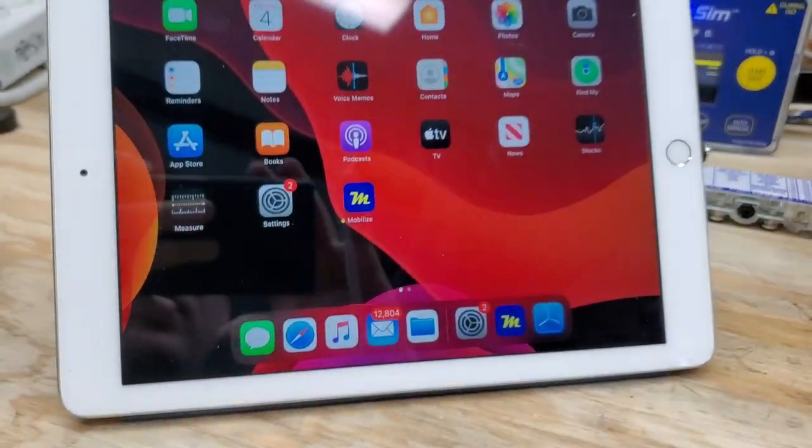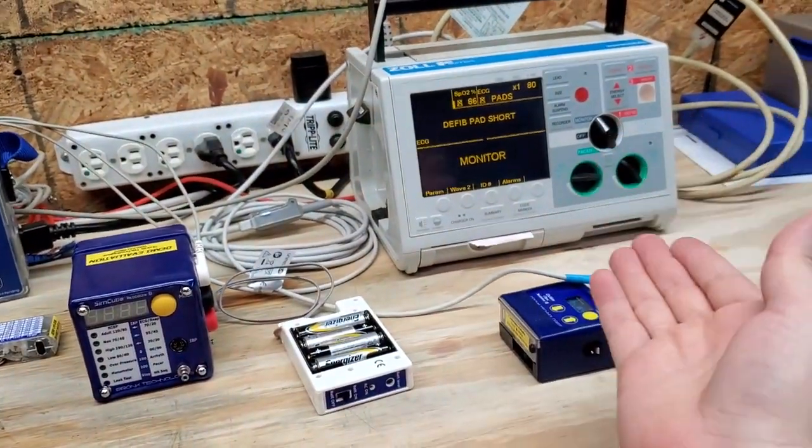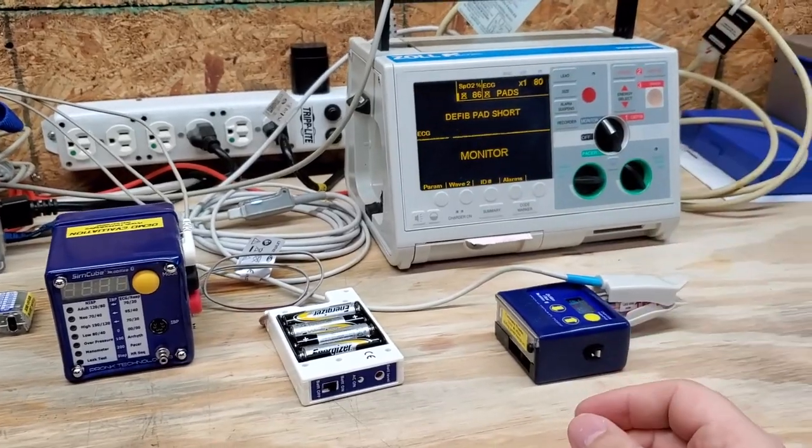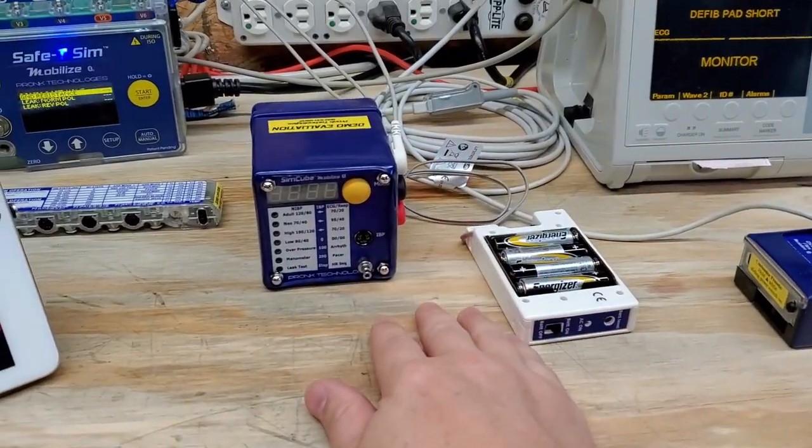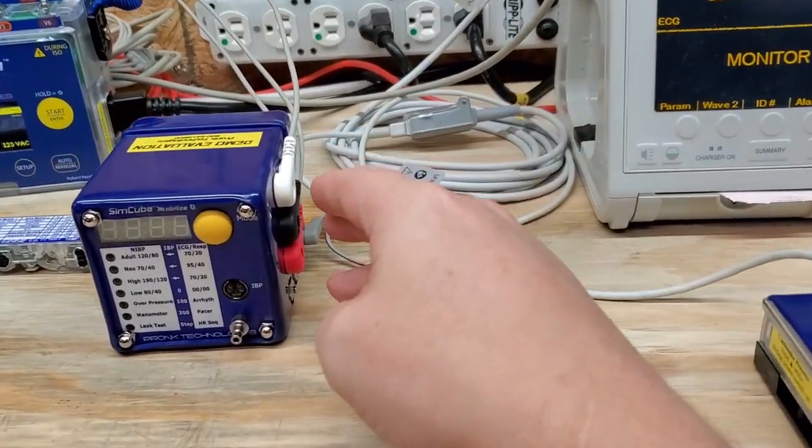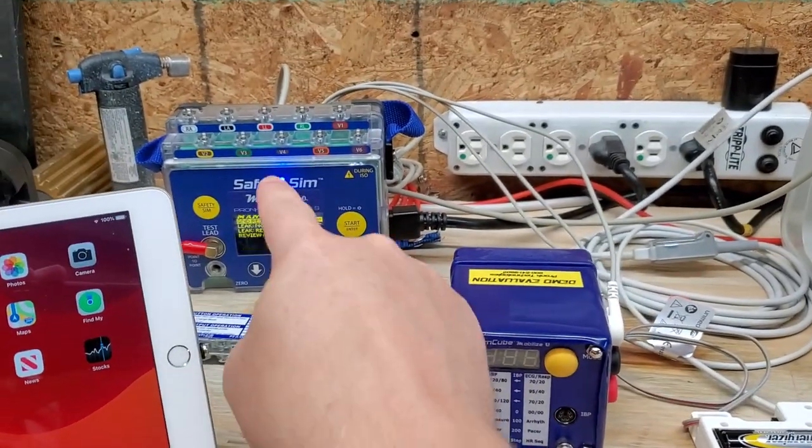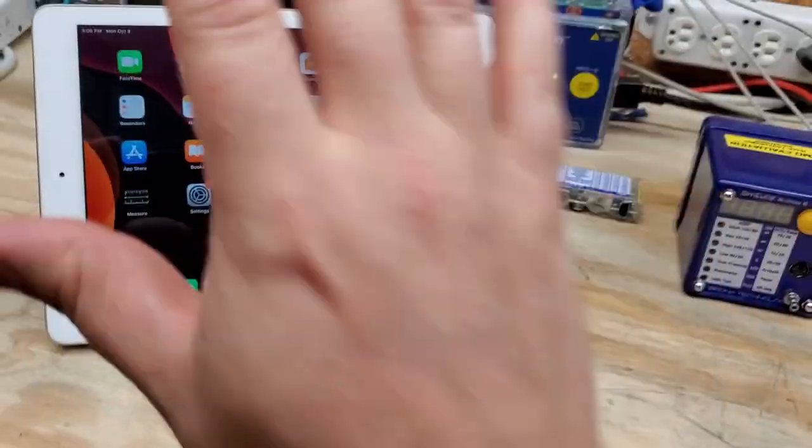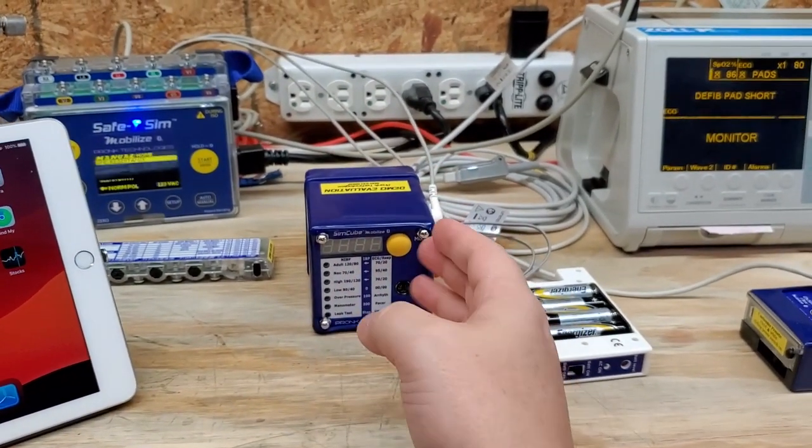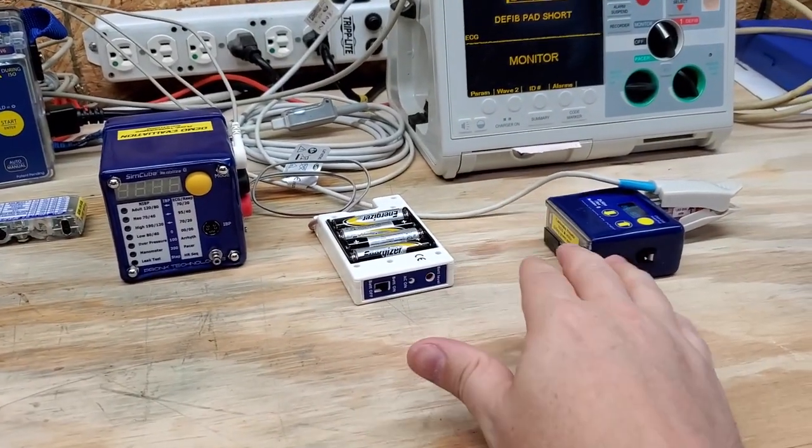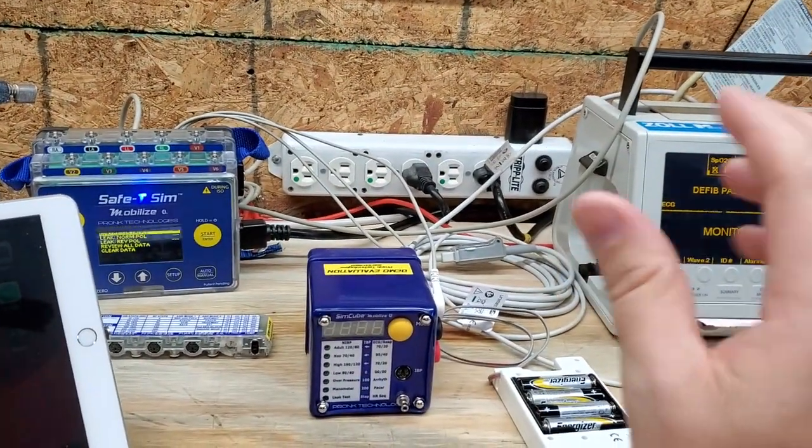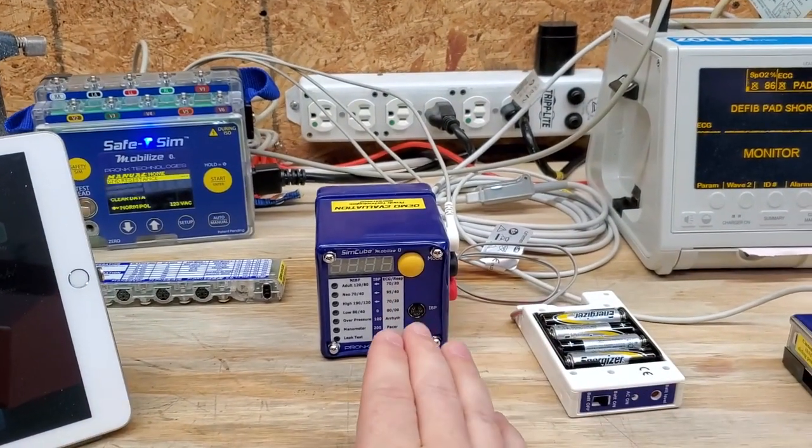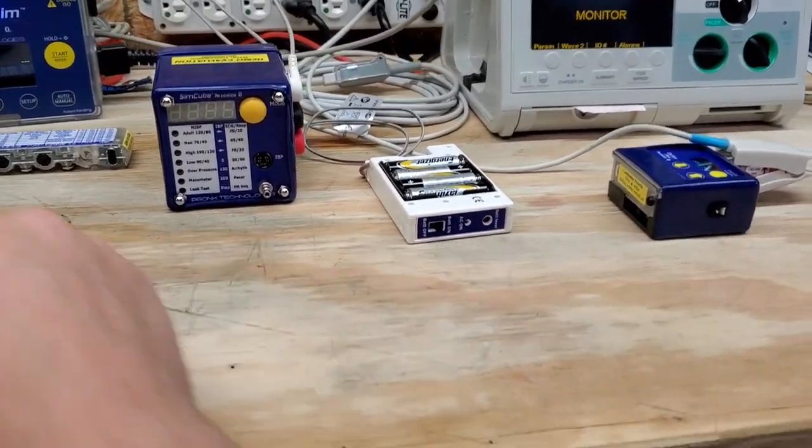I currently have everything kind of set up. I've got a defibrillator set to monitor. I've got the SpO2 simulator here. I've got the non-invasive blood pressure monitor. I do have the ECG. There's redundancy built into these products, but I figured to show you how many devices we can daisy chain to the Mobilize app. I could have done it through the safety SIM, but this guy's running off battery power. Now I'm going to do an electrical safety, run it through some functions with ECG, and also run it through some SpO2 functionality.